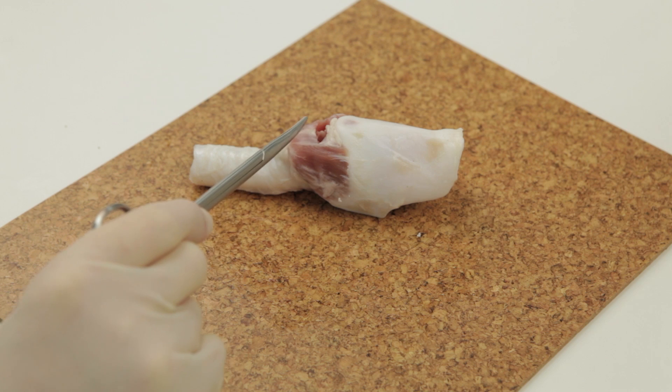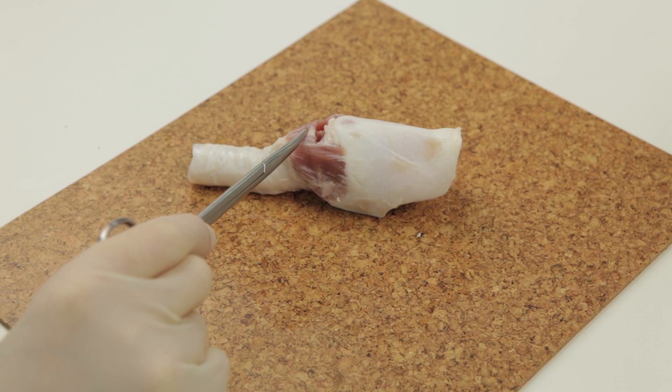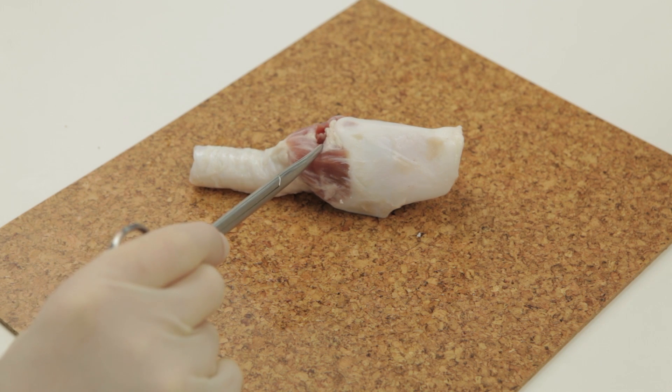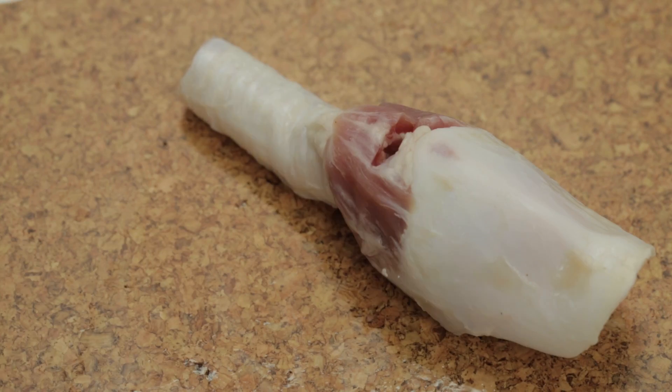For this station, we use an ovine larynx covered with skin. Here, we have removed the skin so you can appreciate the anatomy. The cricothyroid membrane has been incised.